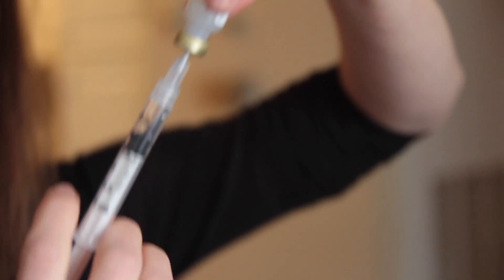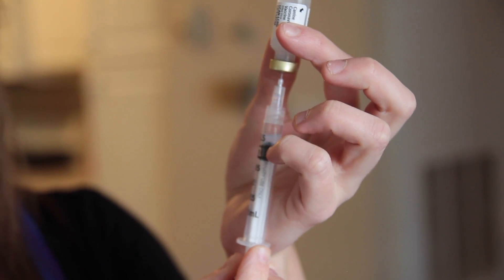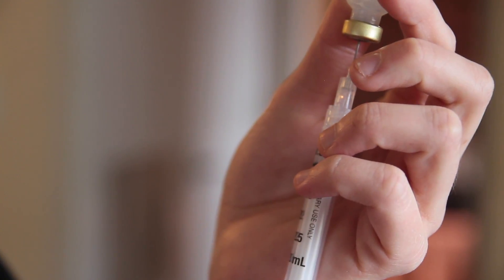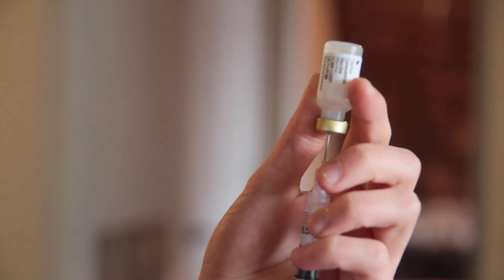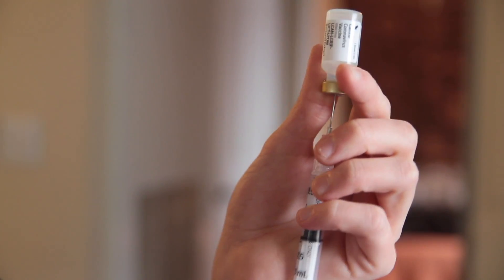So you put the needle into the vial. I did put a little room for air in there, otherwise it'll create a vacuum. So you push the air in, then you pull. I'm not in the fluid — you have to make sure that your needle's in the fluid. Pull the fluid out, it might be kind of thick too. You don't want the needle all the way in there. Once you get to the bottom of the fluid, the fluid's going down.